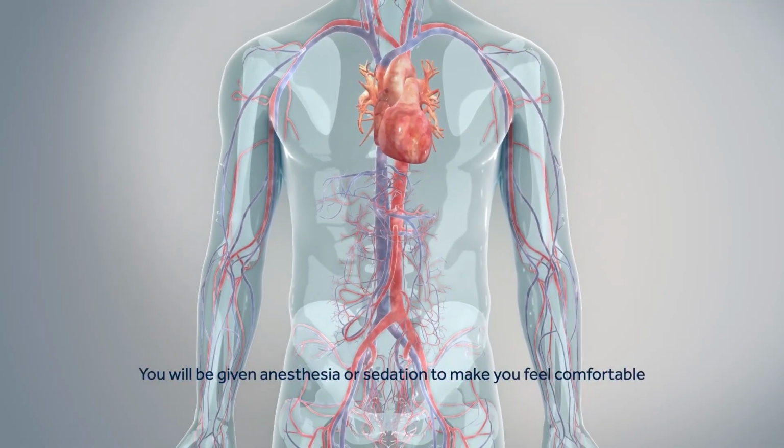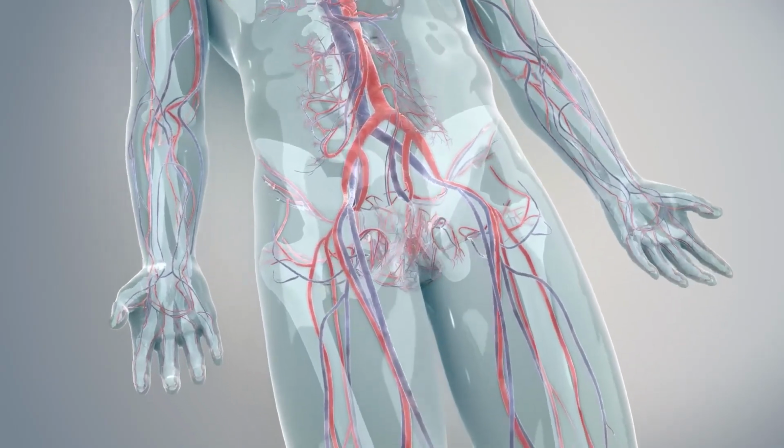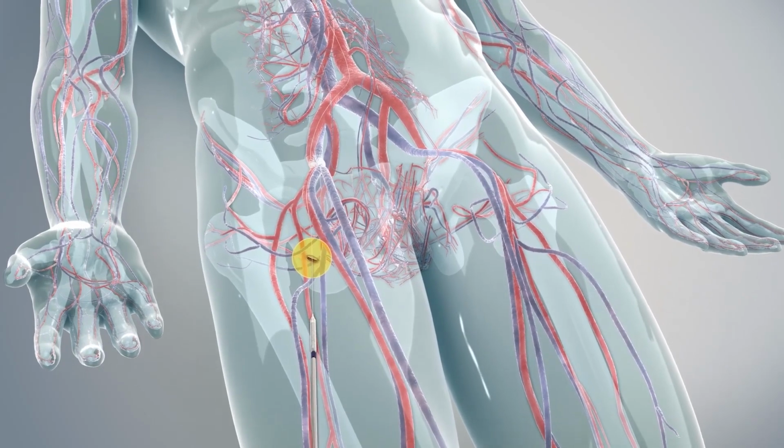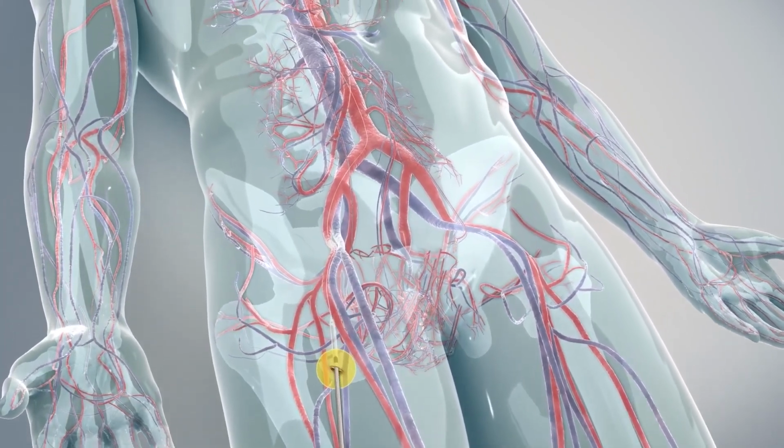Now, in this particular treatment procedure called TAVR, the procedure is done under conscious sedation. The patient is generally not anesthetized unless there is a special reason to do so. The procedure is done through the groin. We give local anesthesia in the groin, and through a large bore sheath, the valve is delivered across the opening between the left ventricle and the aorta.